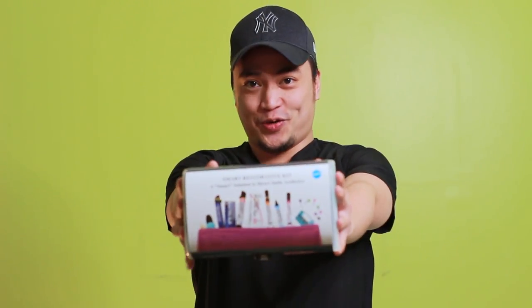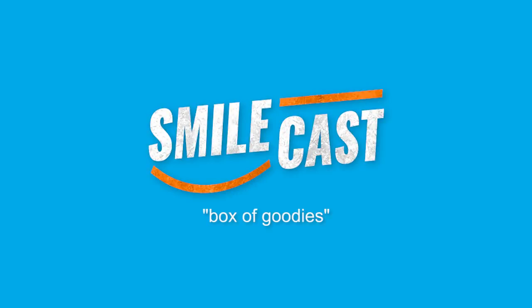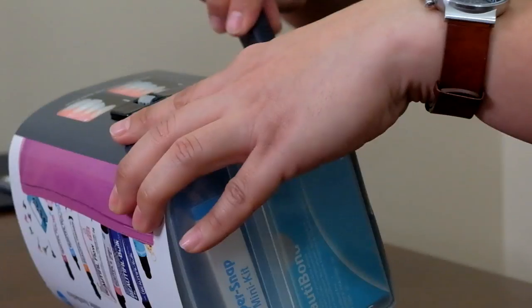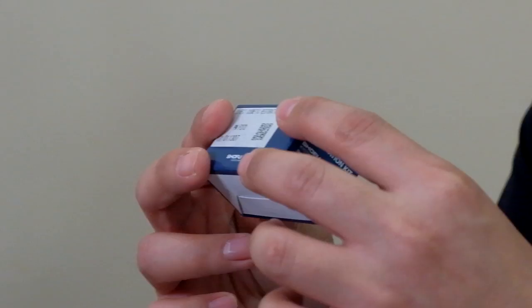We have here the Smart Restorative Kit from Shofu. Let's pop it open, shall we? We have a direct cosmetic restoration kit.